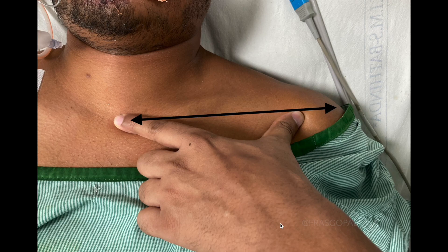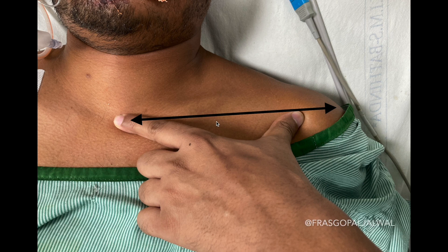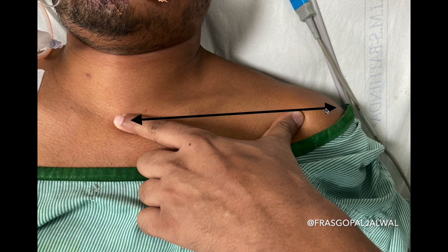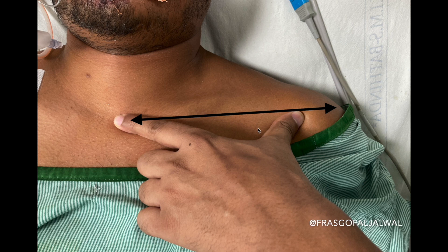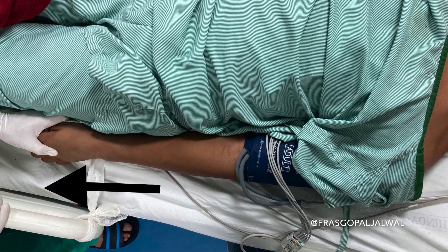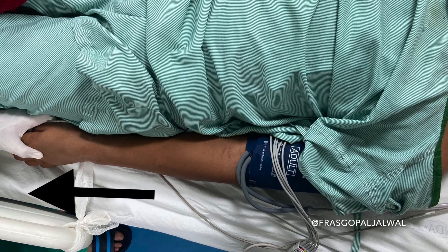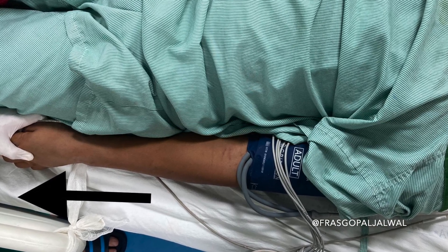For insertion of the subclavian CVP line, the patient should be placed in the Trendelenburg position. As you can see in this picture, my index finger is at the level of the suprasternal notch and my thumb is at the nearby acromion process. The suprasternal notch and acromion process should be at the same level, which can be achieved by pulling the hand downward.